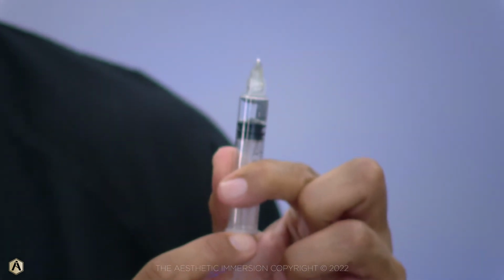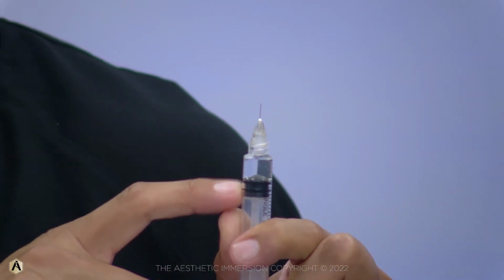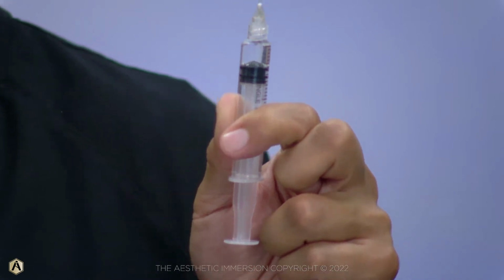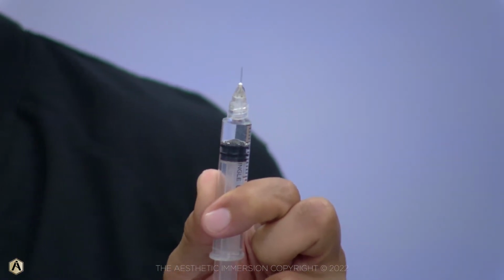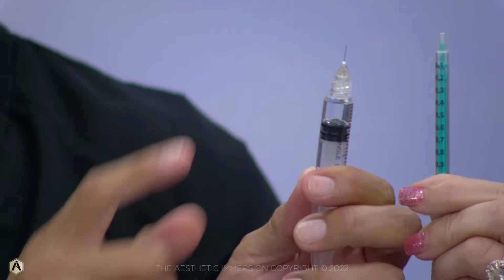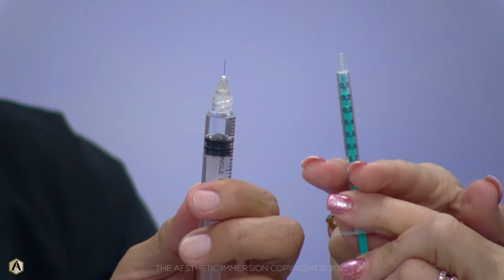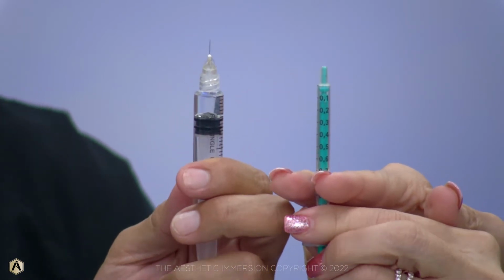So you literally save a lot of money. For those of us that use a 1cc syringe, you can get the green one that actually has a male end in here as well. Can you hand me that, actually, the 1cc with the green? That one saves a lot of money, because if you concentrate your product, you have a lot of waste in this area. Even a little tiny bit could end up costing you a lot of money in wasted neurotoxin. I know a lot of people use insulin syringes. I personally don't like them that much, because you end up going through a ton of insulin syringes sometimes. You can see there's going to be less waste because the male hub goes into there. You get no waste, and then you get no waste from here.